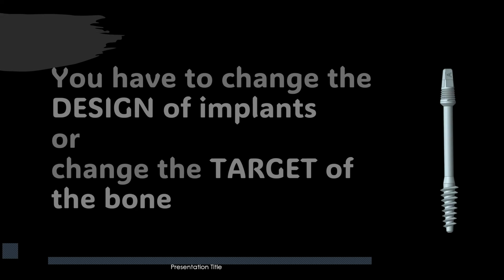So now we have narrow ridges, and we know that we have an implant which is even 2.7 millimeter in diameter. Even if it is a knife edge ridge, with a knife edge at the apical portion, a 3.5 or 4, or in fact a 3, is available at the base. In that condition, you can use these implants to engage your bone.